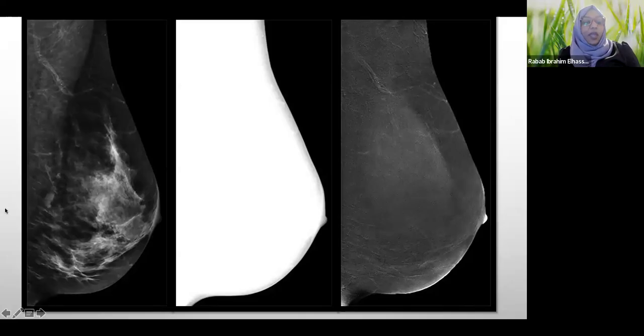So this is the low energy image, which is similar, as I said, and not inferior at all in the details provided to a conventional mammogram. And this is the high energy image, which, as you can see, we cannot see anything in by the normal human eye. And this is the recombined image, which will eventually show us the areas that enhance. This process is all automatic.